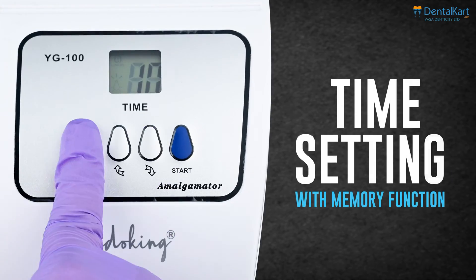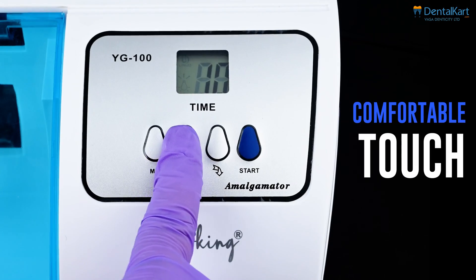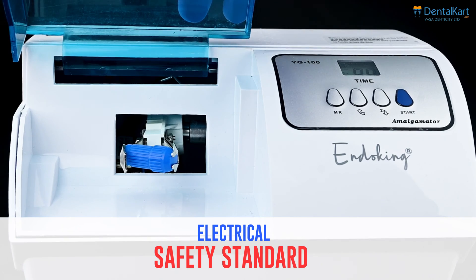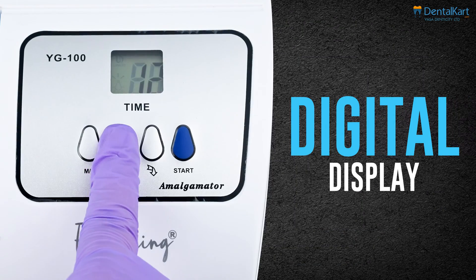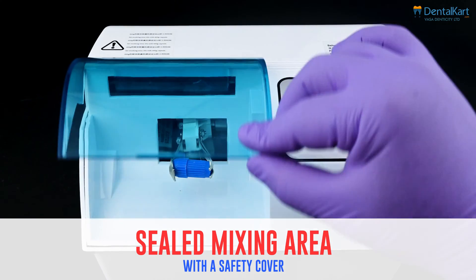Key features include: time setting with memory function, silicone rubber buttons for a comfortable touch, electrical safety standards met, easy maintenance, digital display, strong mixing power, and a sealed mixing area with a safety cover.